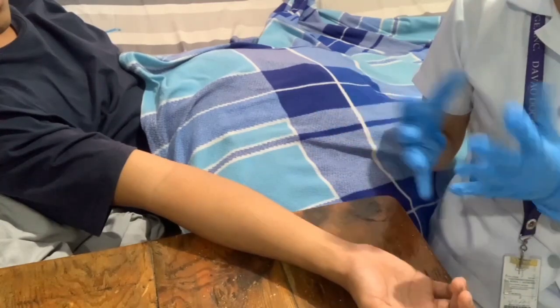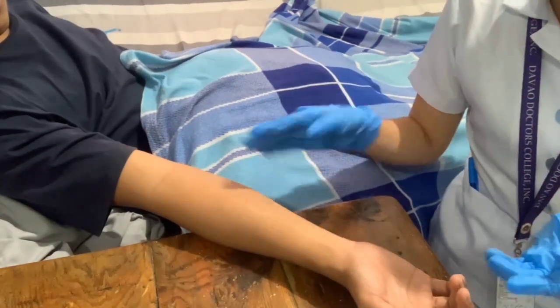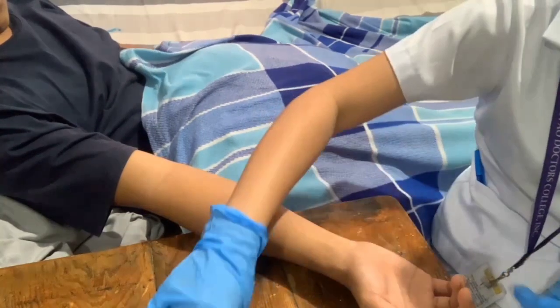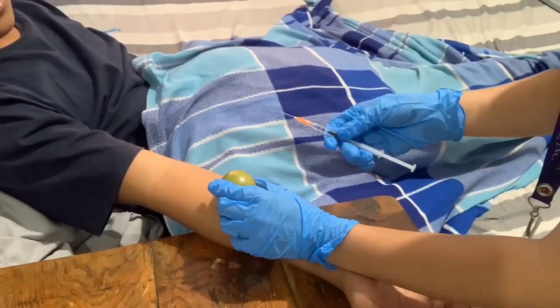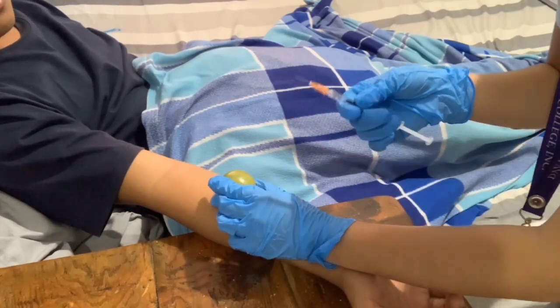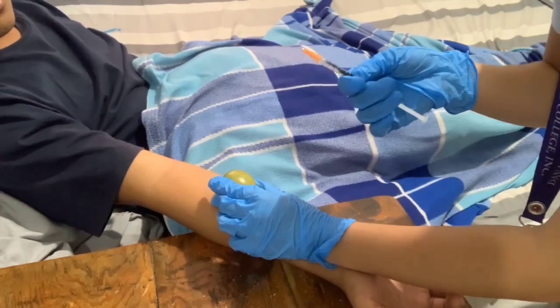So as I have already applied my gloves, now I'm just going to allow the area to dry as I also prepare the medication. Okay, so before we inject the medications, we're just going to make sure that there are no air bubbles in the syringe.